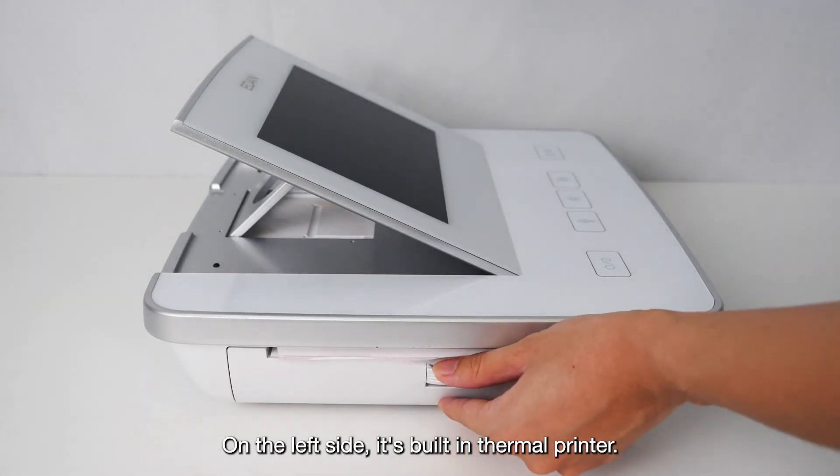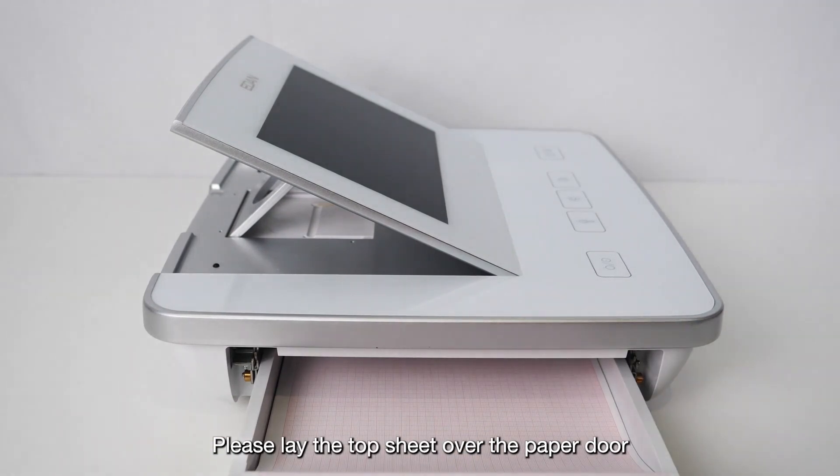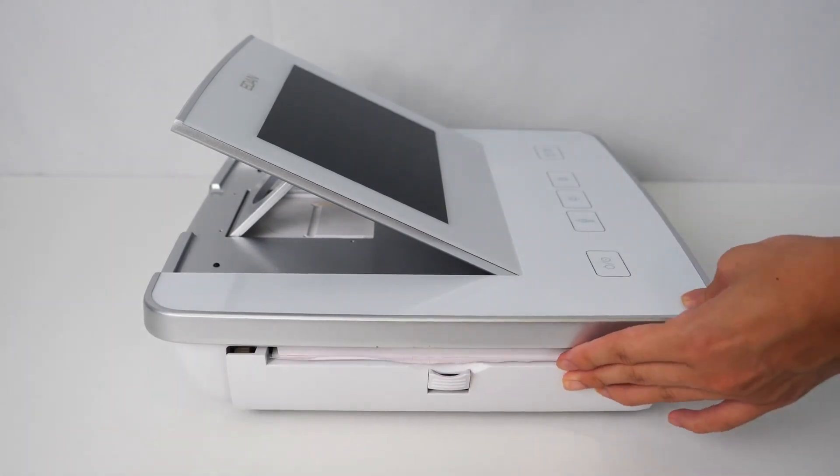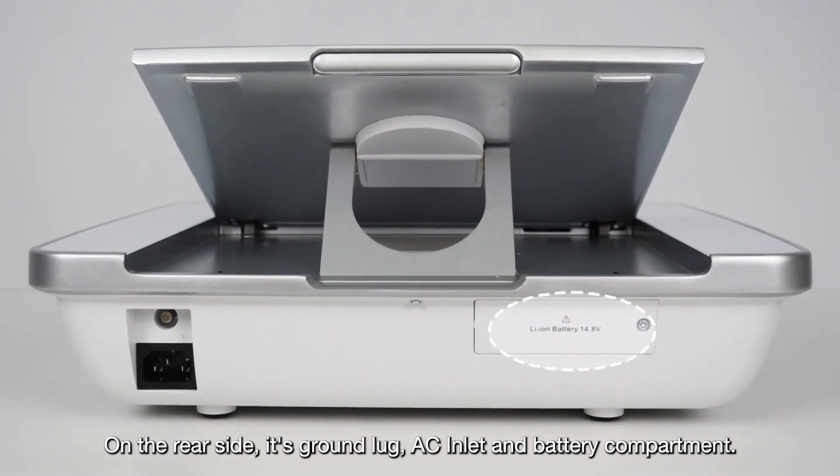On the left side is the built-in thermal printer. Please lay the top sheet over the paper door when installing the thermal chart paper. On the rear side are the ground lug, AC inlet, and battery compartment.